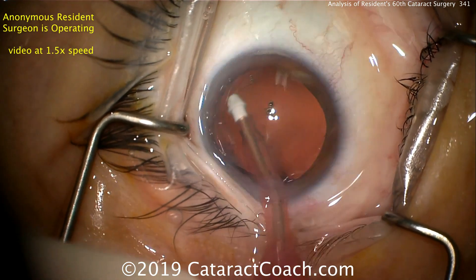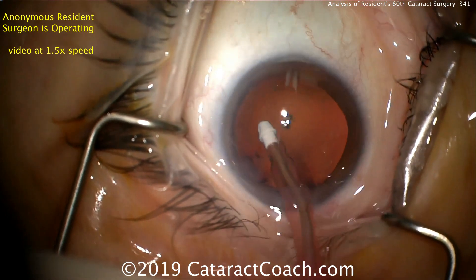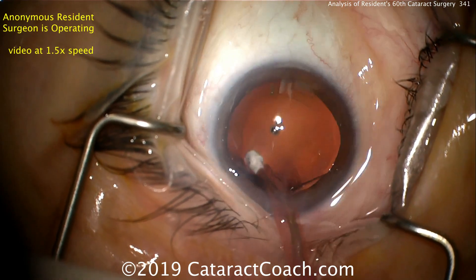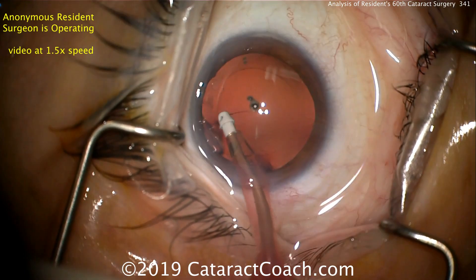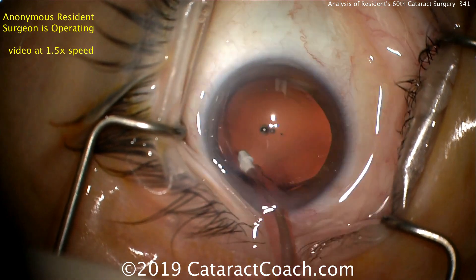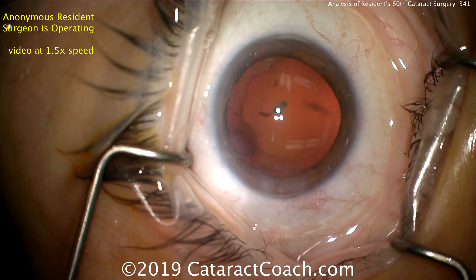Cleaning up the capsular bag quite nicely — a little bit of capsular polishing going on here. That looks pretty good. Let's take a look around and see the incisions. The main incision looks pretty good, maybe a tad on the short side, but I'll take it. The paracentesis I think is a little bit too long and has some edema there.